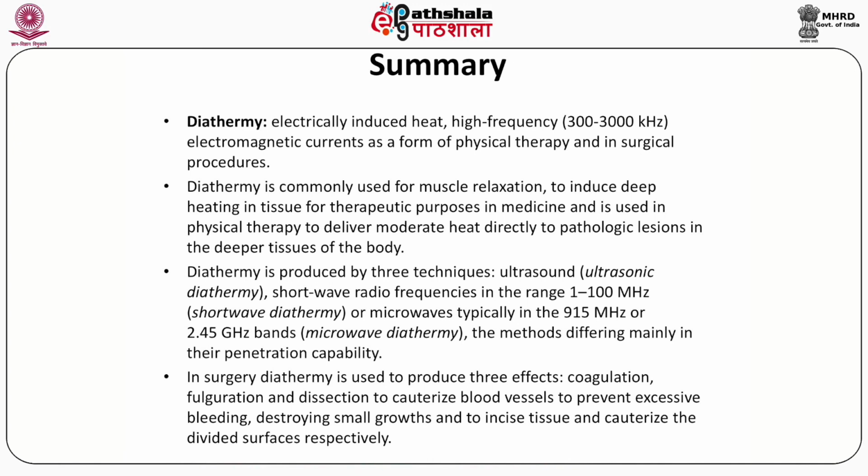Diathermy is produced by three simple techniques: ultrasound, called ultrasonic diathermy; shortwave radio frequencies in the range of 1 to 100 megahertz, called shortwave diathermy; or microwaves, typically in the 915 megahertz or 2.45 gigahertz bands, called microwave diathermy. The methods differ mainly in their penetrating capability.